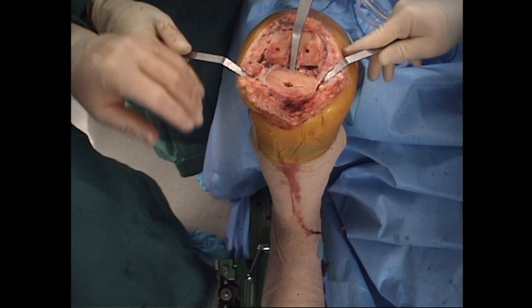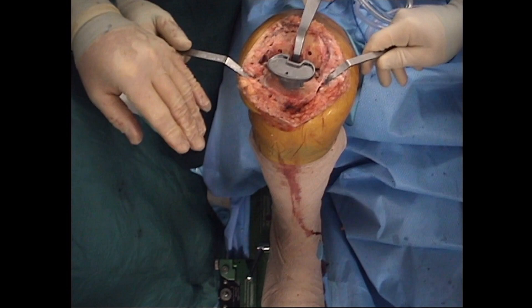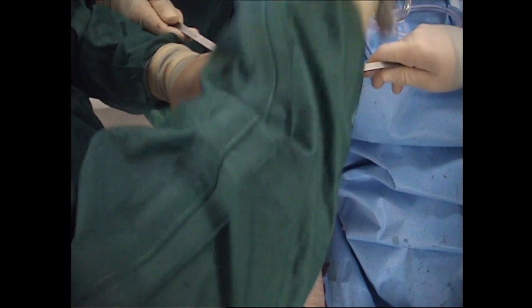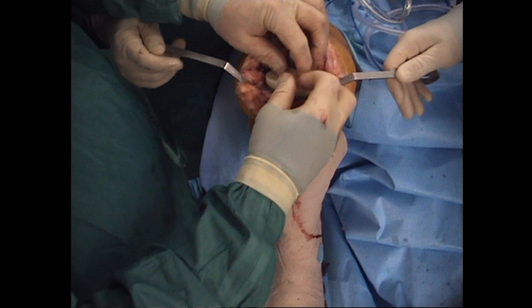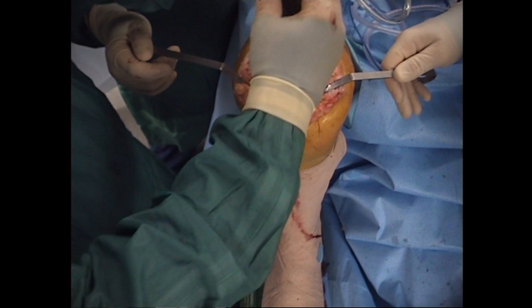The final press fit classic tibia is then impacted. Care is taken to make sure the tibial component is being impacted both medially and laterally at the same rate, as well as anteriorly and posteriorly. This is checked and final impaction is then performed. The final polyethylene insert is placed and locked down with a screw mechanism to avoid backside wear.